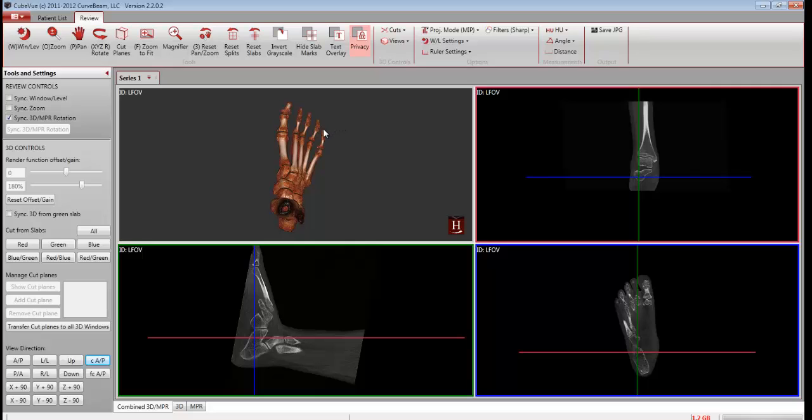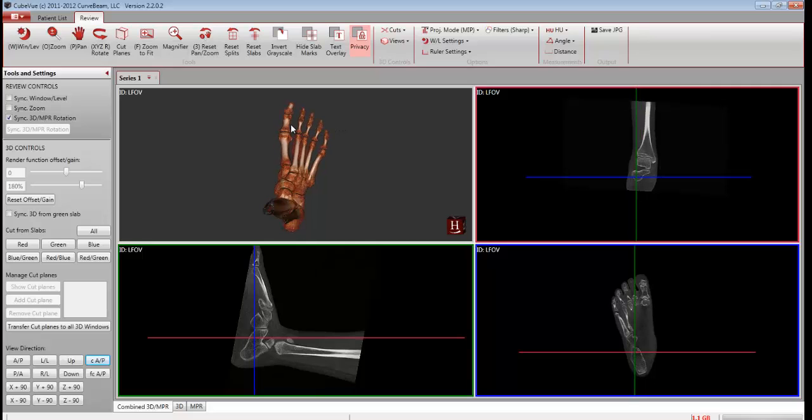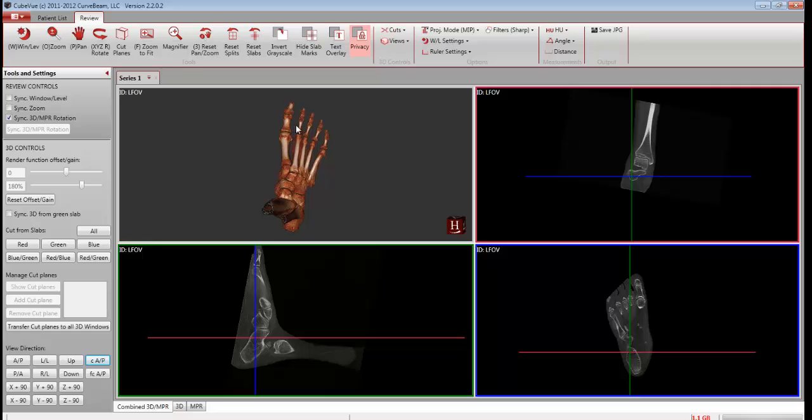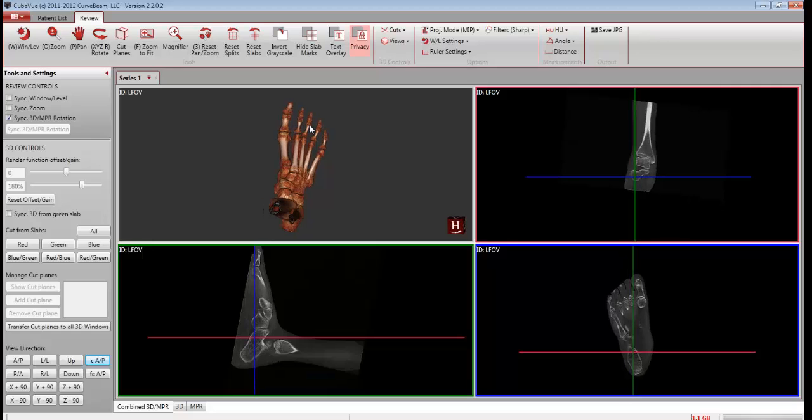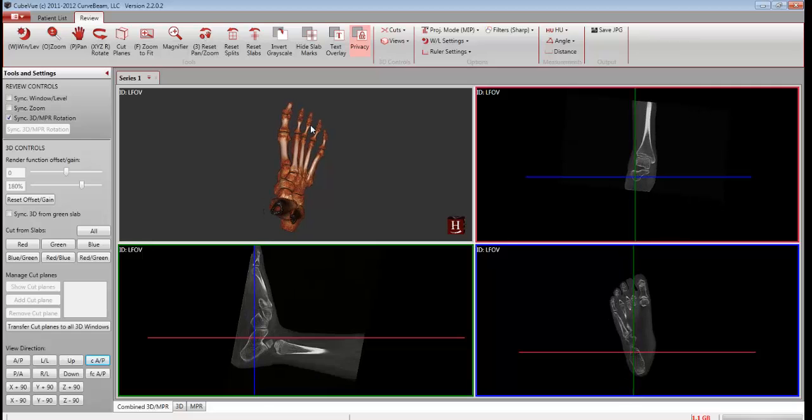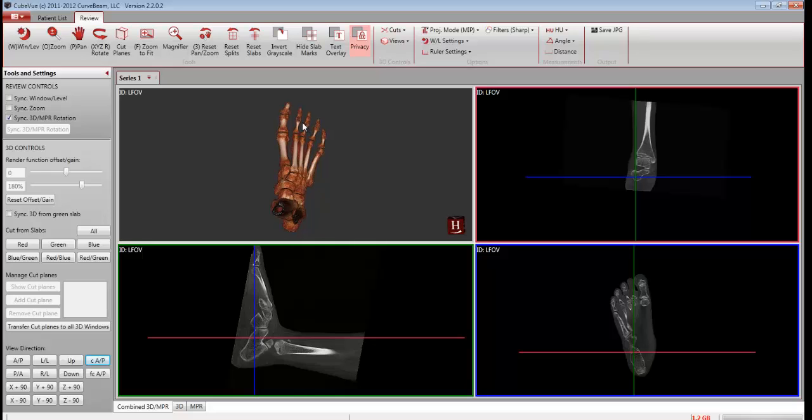Then do so by holding down either the X key while rotating in the 3D rendering for up and down direction, or the Y key to rotate in the left or the right direction, or the Z key to rotate in counterclockwise, clockwise direction.